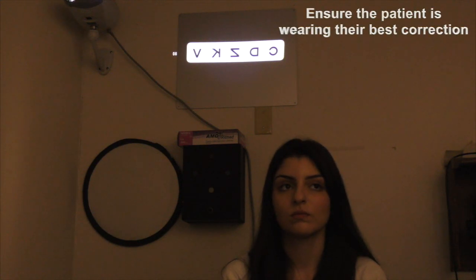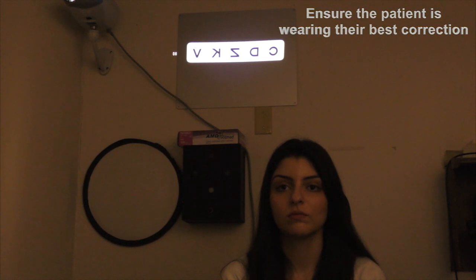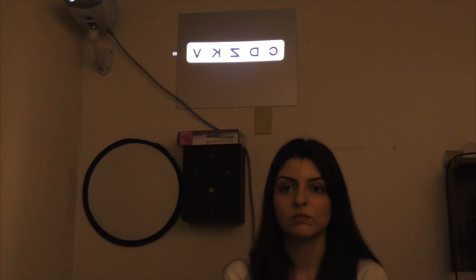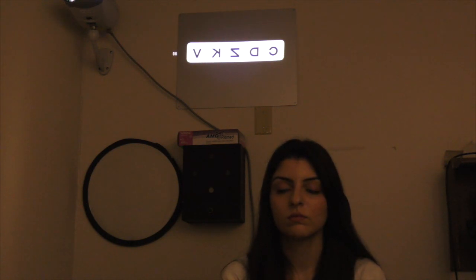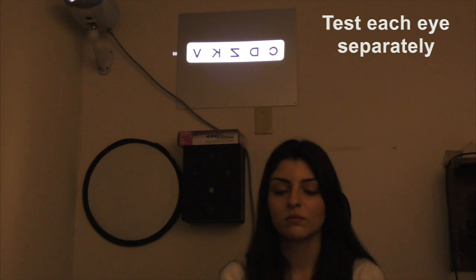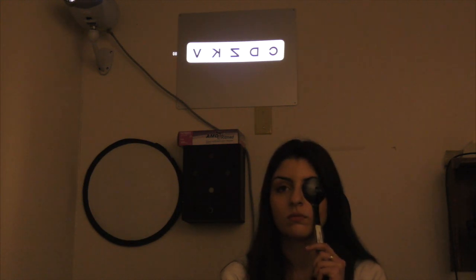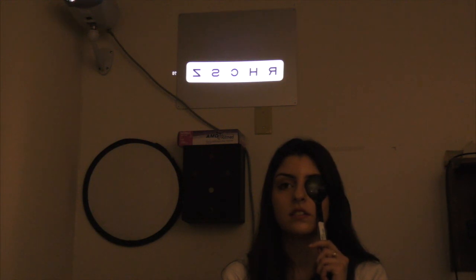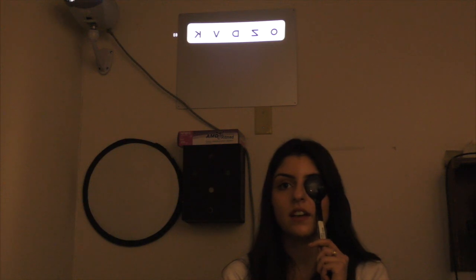Now that we have the optimal exam settings — the room is dark, lights are off — you get good contrast with the projector screen and you're ready to check visual acuity. I like to start my default exam at about 20/80 or 20/70 and work my way down to 20/20. Once you get to 20/20, you can stop. If the patient's baseline vision is worse, you can start at 20/100 or 20/400. Here we have the projector at 20/80. Starting with the right eye: Sumaya, please read the letters from beginning to end. C, D, Z, K, V. Very good.